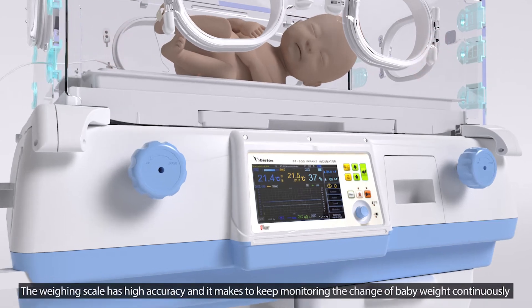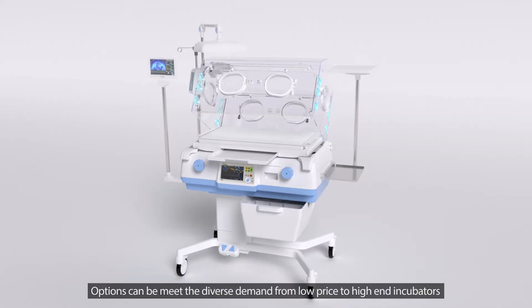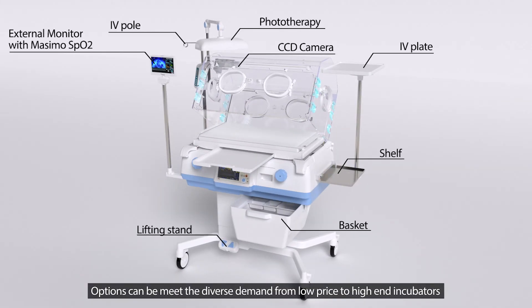The weighing scale has high accuracy and monitors the change of baby weight continuously. Options can be adjusted to meet diverse demands, from low-price to high-end incubators.